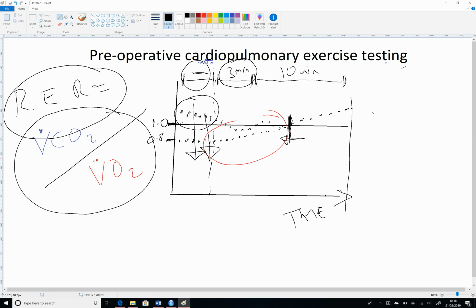So in this tutorial 1.4, I've just consolidated the anaerobic threshold identification and introduced the graph of respiratory exchange ratio, which you should refer to to determine whether you can reliably identify the anaerobic threshold. In tutorial 1.5, I'll be talking about some other normal responses to exercise that you should be familiar with. And then in subsequent tutorials, we'll look at some abnormalities, some common abnormalities.